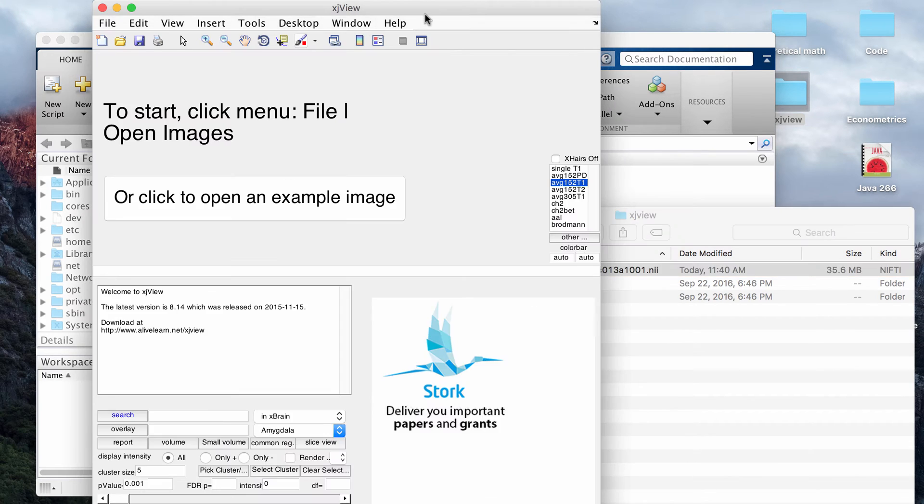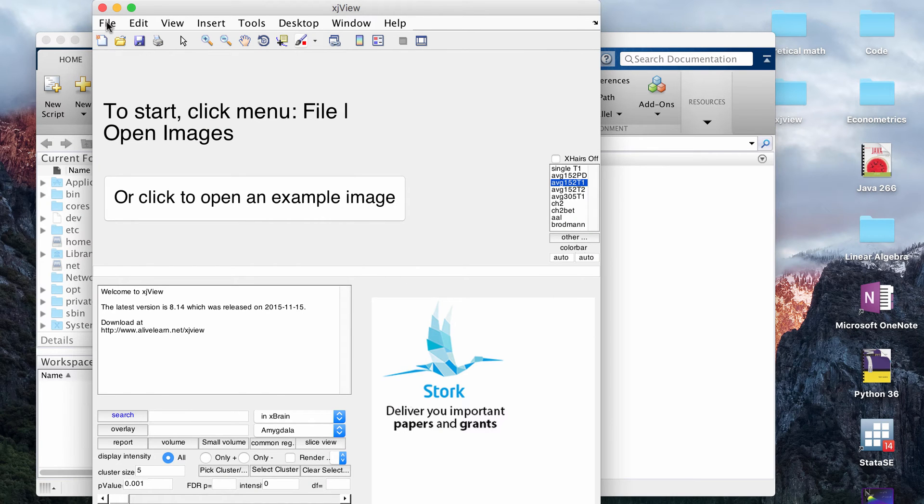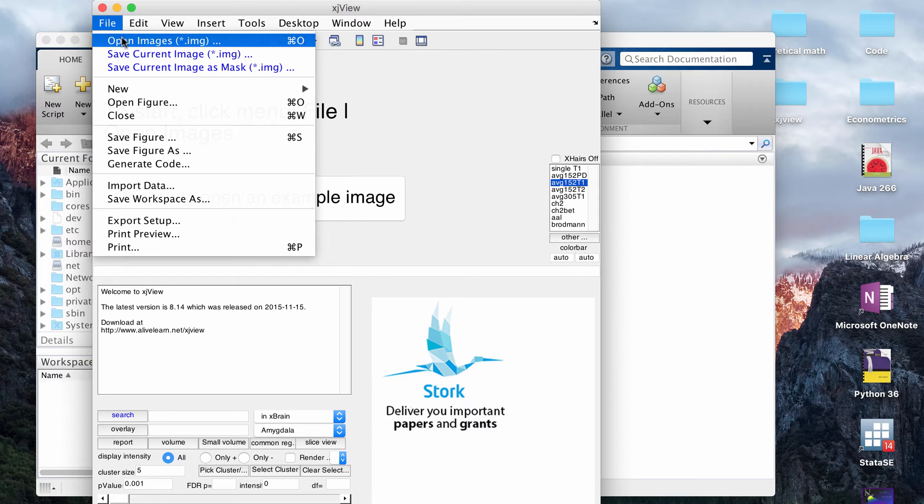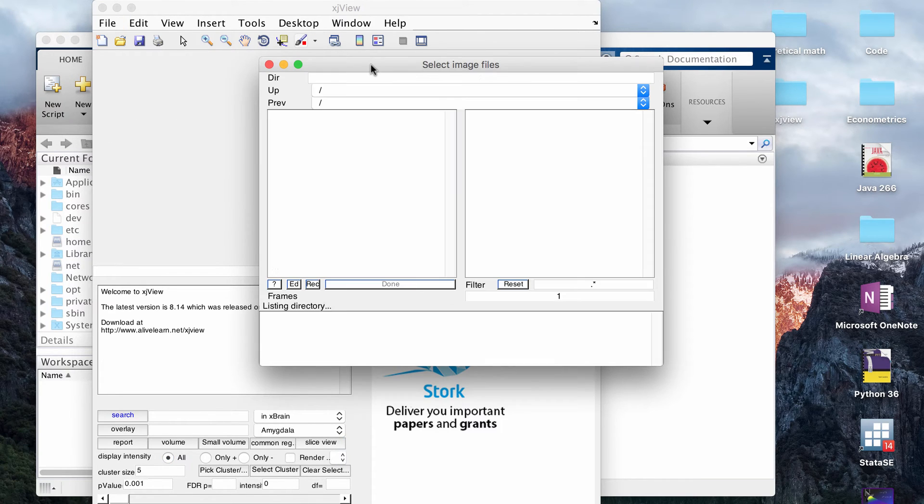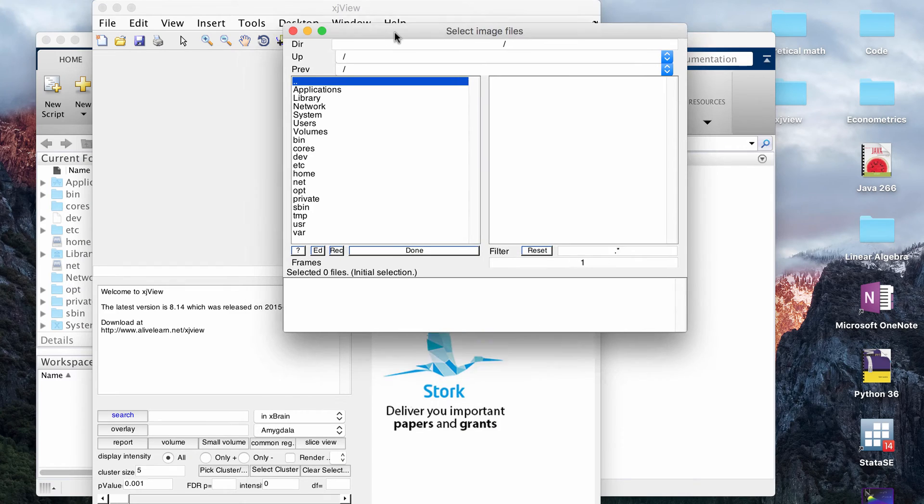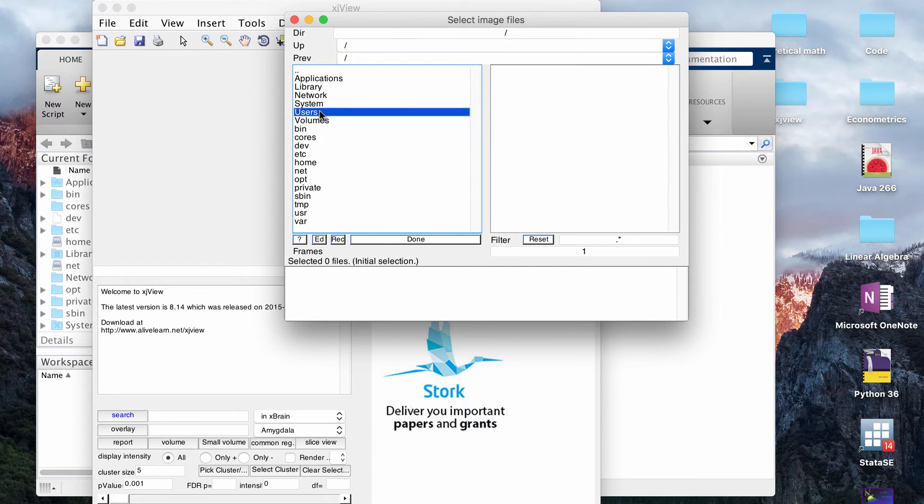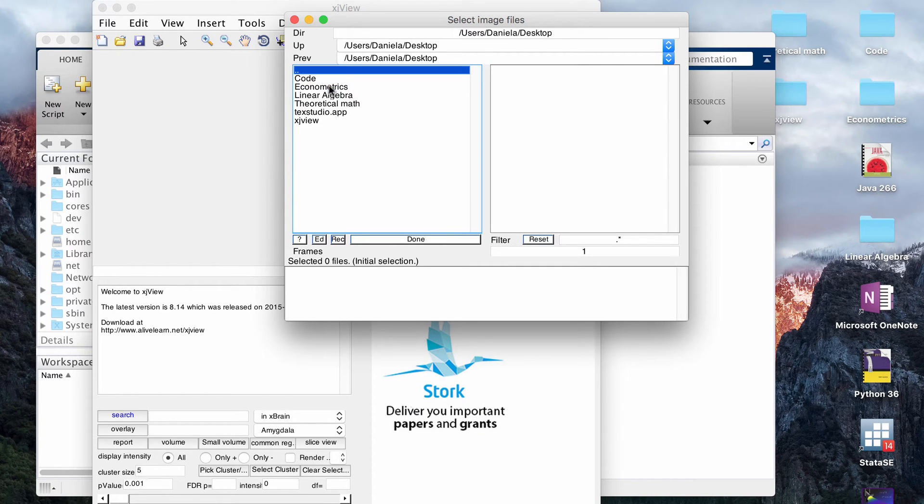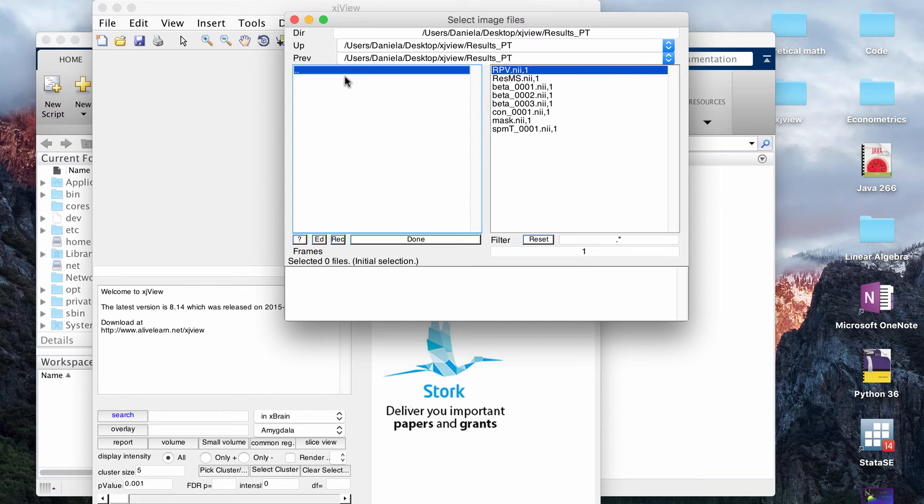Now let me show you the VBM window. Once this shows up it tells you to go to file, open images, and it says to pick .img files. When you do VBM using SPM or cat12, which is what I use, then it will actually produce nifty files, but that's fine because XJView can read in nifty files as well so it doesn't have to be a .img file.